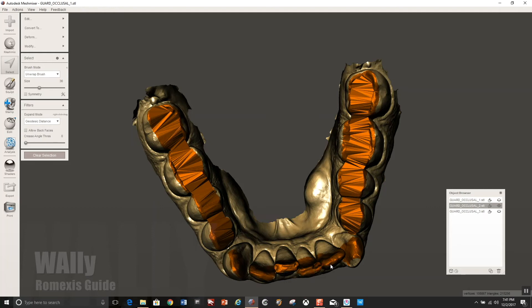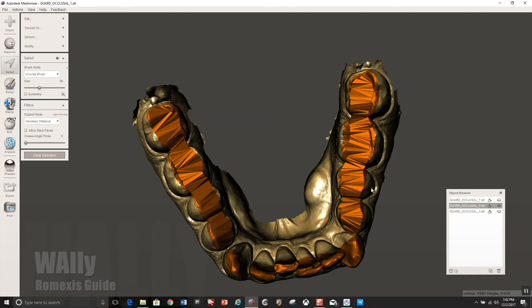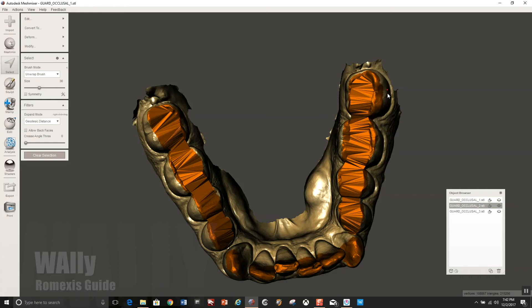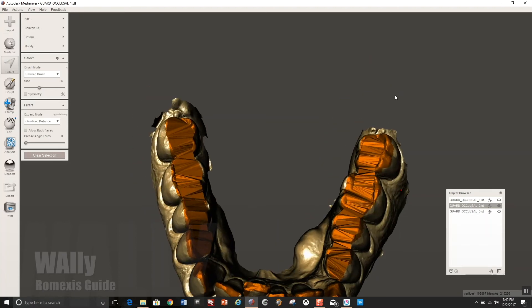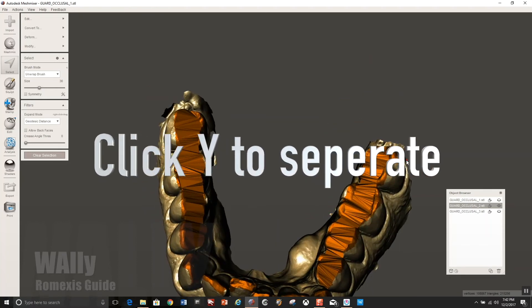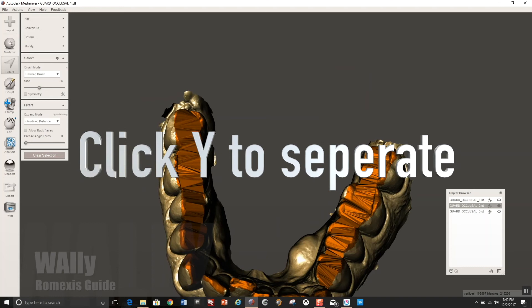Now in real time, this takes maybe like a minute, but when I'm going slow to try to show you guys, it takes a little bit longer. In fact, the whole process is about a 10 minute process.